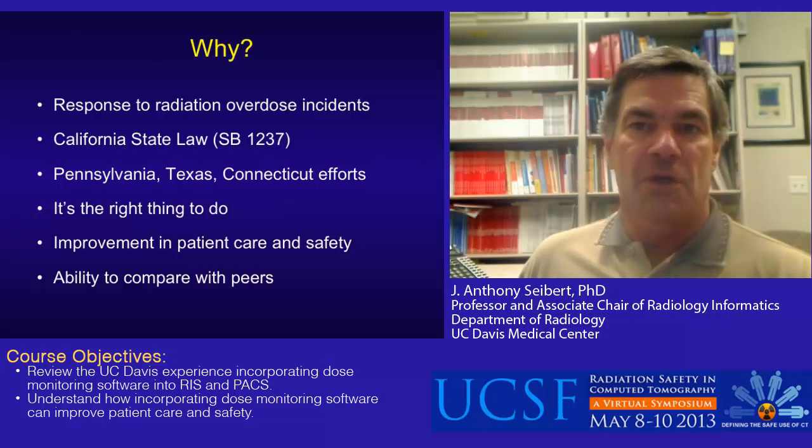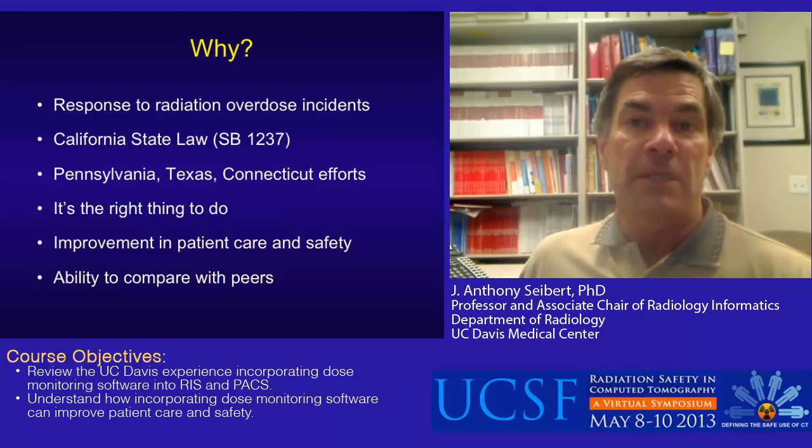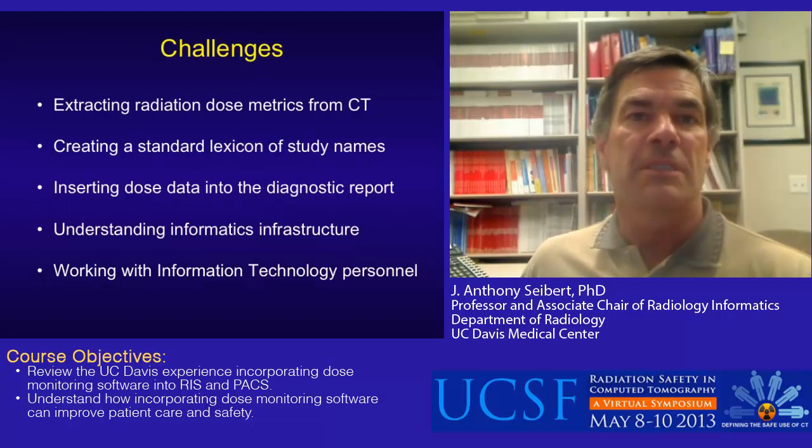Efforts in other states are underway to get their own legislation invoked. It is the right thing to do for patients and their safety. In addition, dose reporting and tracking provides a mechanism to compare practices and develop low-dose protocols and techniques.